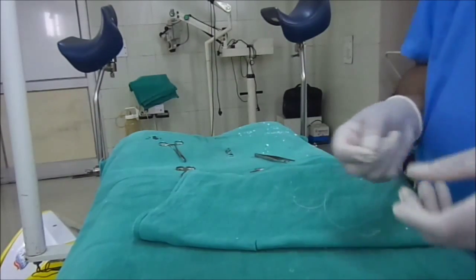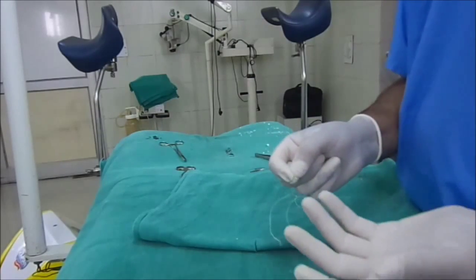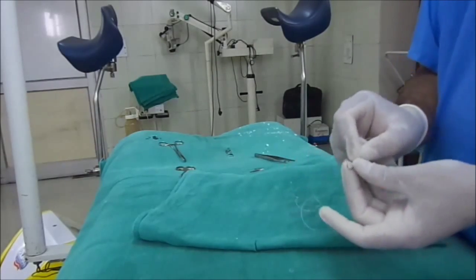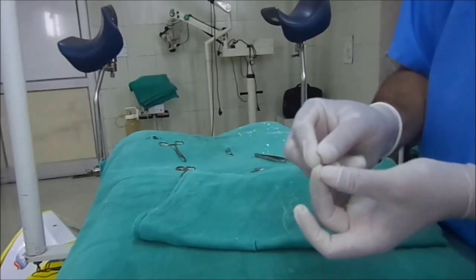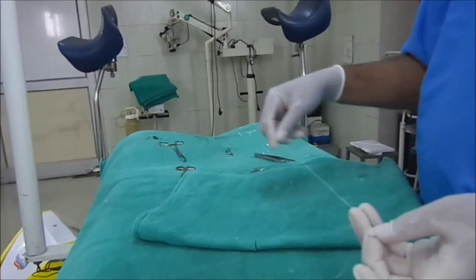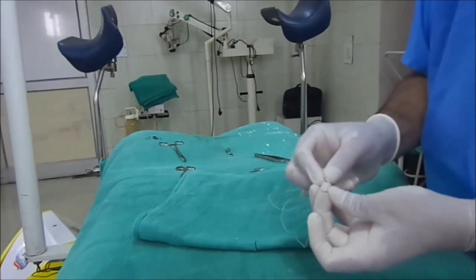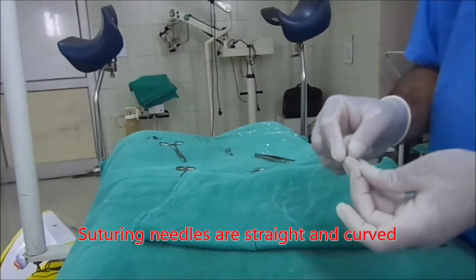The basic unit is a surgical needle. Needles are of many types — they may be straight, cutting. This is the curved, half curved, and cutting needle with an eye. I have put a thread in the eye of the needle, so it is a traumatic needle because this eye may cause trauma while piercing through the tissue.